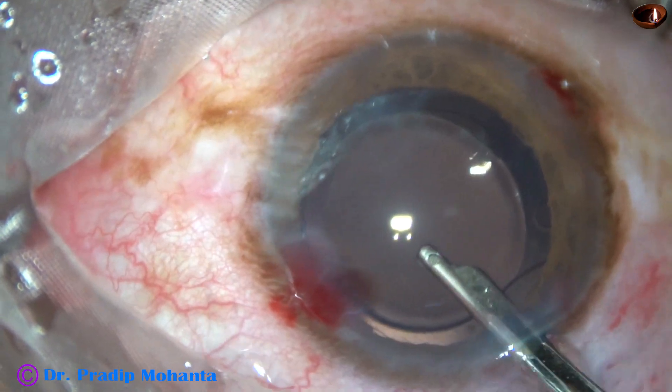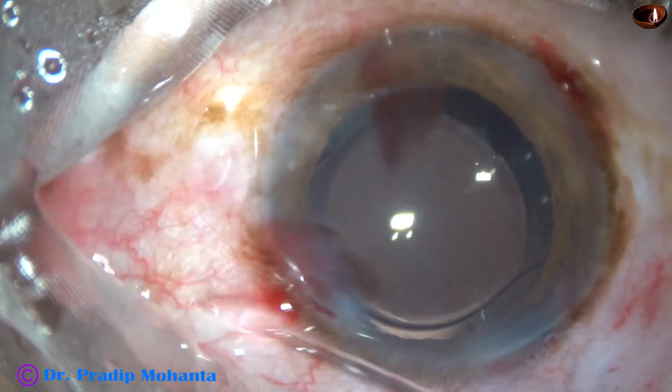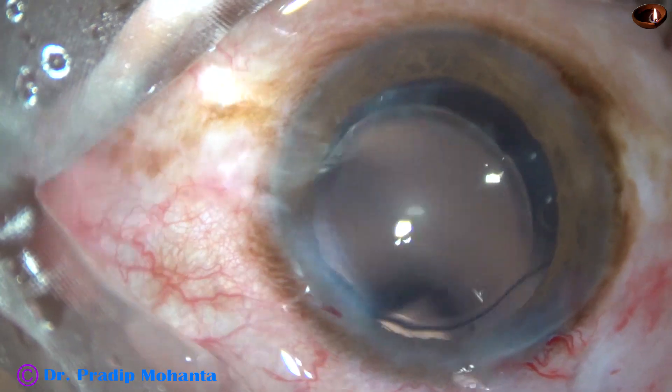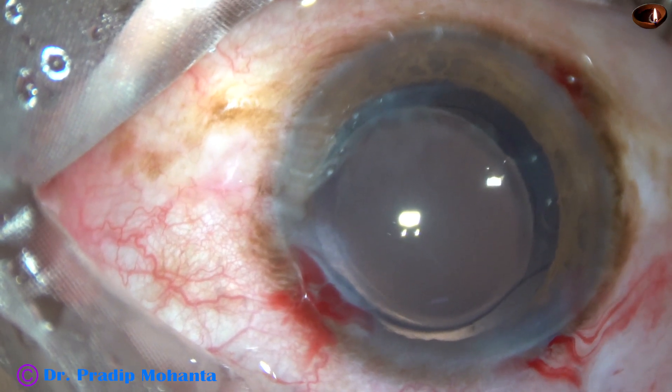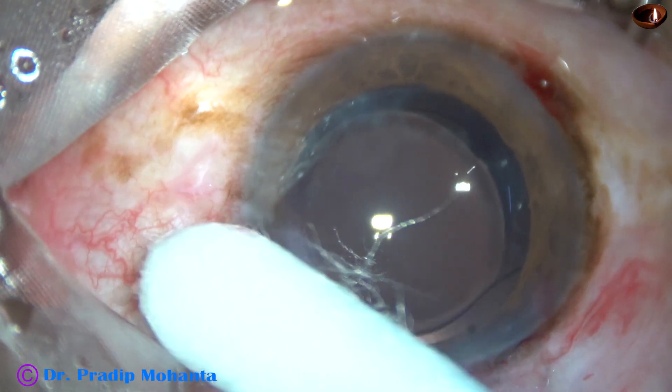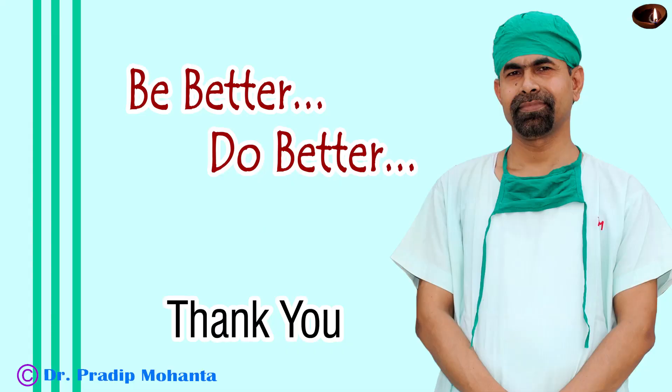This is the final lavage of the anterior chamber. The anterior chamber is lavaged thoroughly, the air bubble is formed, and the integrity of the wounds is checked. A few drops of moxifloxacin are applied over the ocular surface and the case is concluded. Thank you very much for your attention — hope this video will help you develop your surgical skills. Phaco is fun, phaco is fast — please learn phaco.